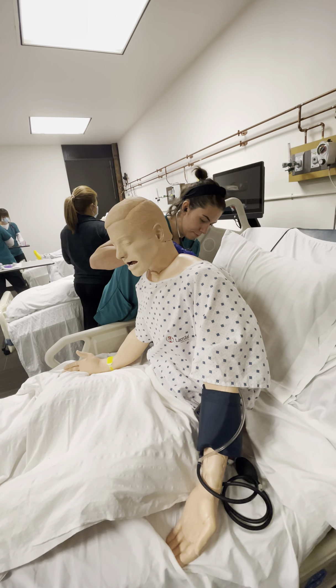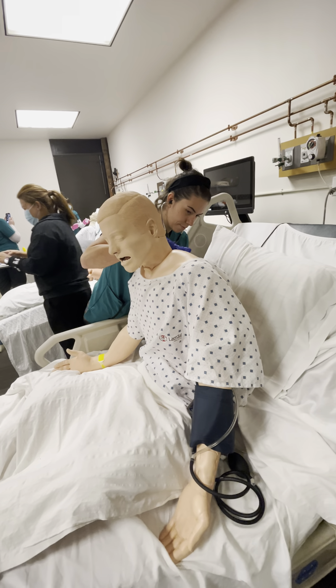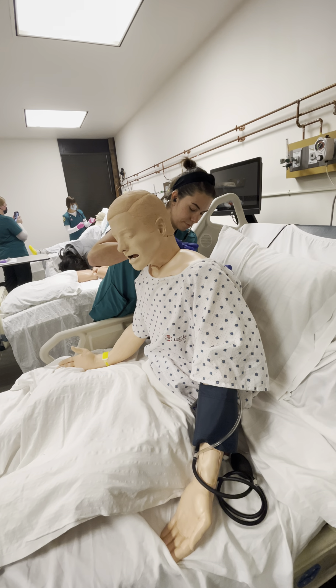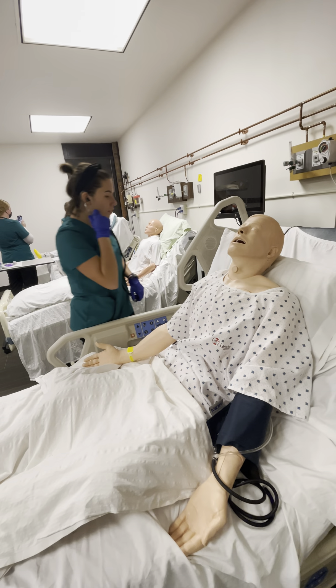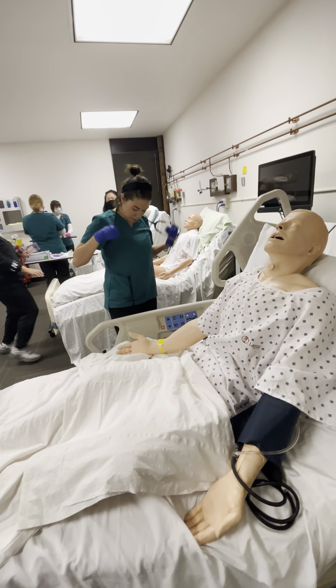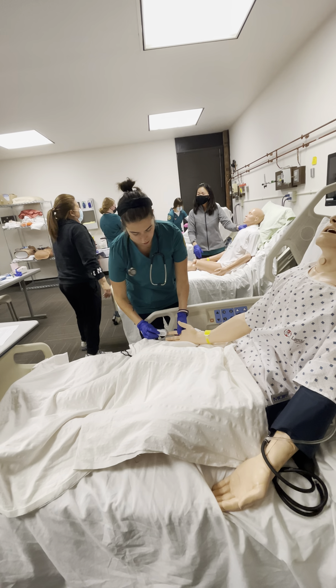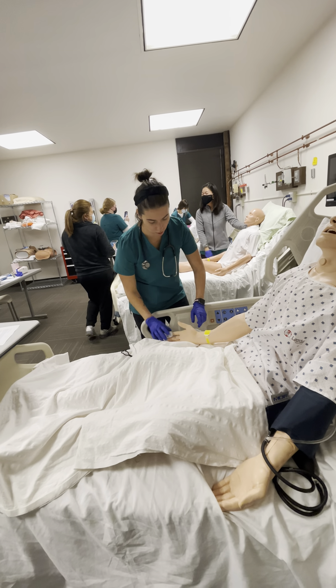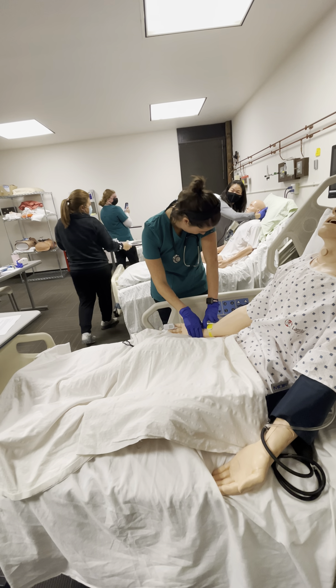Okay, sit up. Nice. How do you feel after that? I'm going to have you rinse your mouth. I'm going to put the pulse oximeter on your finger so we can see how your heart rate and your oxygen is doing.